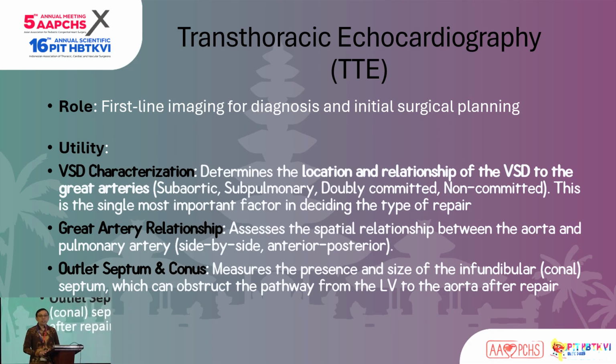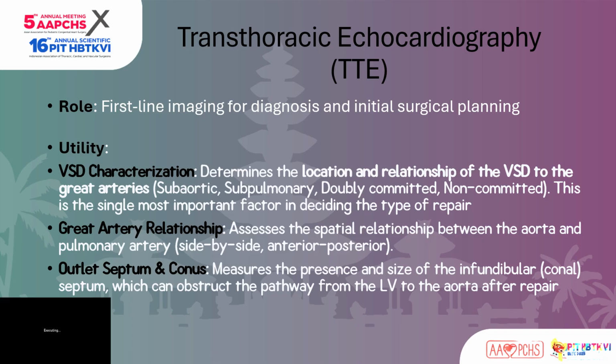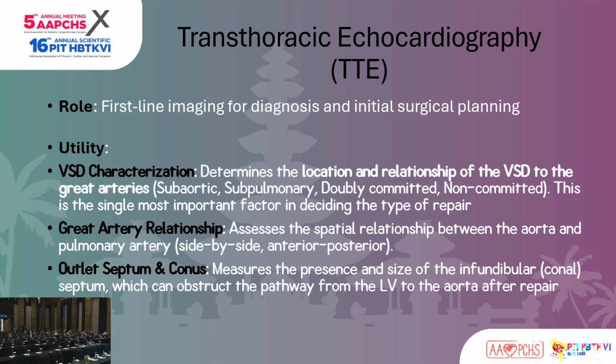The first modality is transthoracic echo. I actually feel this is the most important. Despite us discussing about 3D, about virtual, 2D echo is actually the most important because it is for resource-poor hospital. This is the best form that we can have. It's the most common, and not all DORVs require a CT scan or MRI. Hence, it is very important to have a good echocardiologist. It is also very important for the surgeon before the operation to sit down with the echocardiologist and go through the surgical anatomy. So echo is the first line for us.